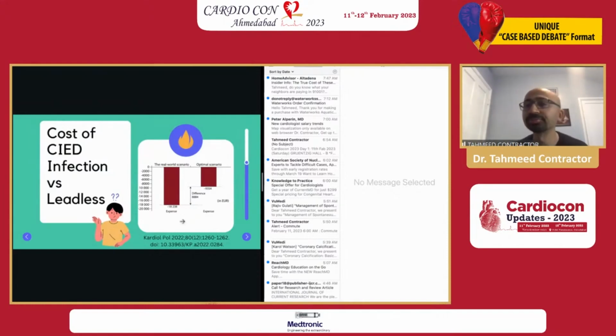She was 80 years old, end-stage renal disease, on warfarin, that required a generator change, a very high risk of infection, obviously, and they ended up doing a generator change to save costs, but she ended up having an infection, multiple hospitalizations, finally had to undergo a high-risk extraction and then leadless pacemaker implantation. And they compared if they had done a leadless pacemaker up front, what would the cost difference be? And you can see that the cost difference is almost double.